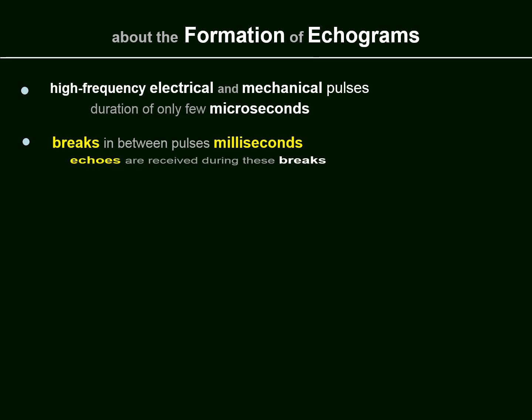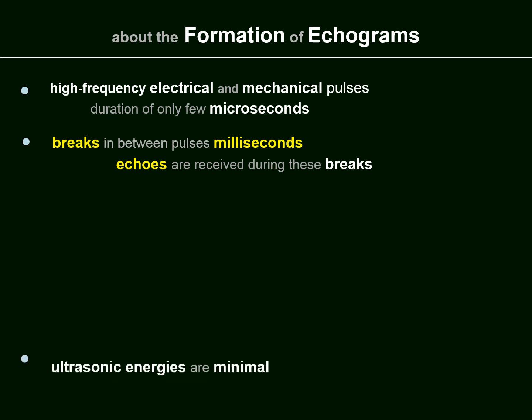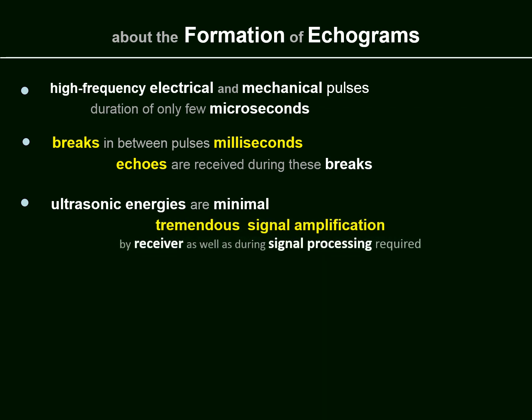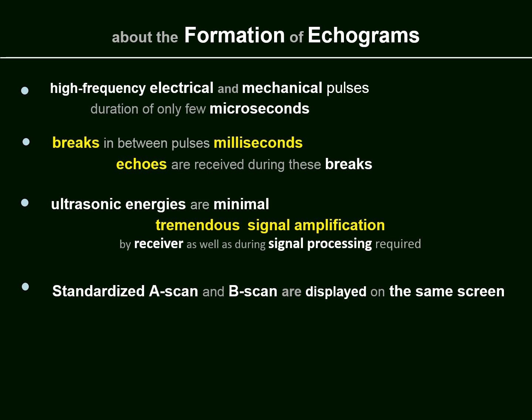In the breaks between the pulses, which are milliseconds in duration, echoes are received, and the ultrasonic energy therefore is minimal and requires a tremendous signal amplification by the receiver and during the signal processing in order to display echograms.